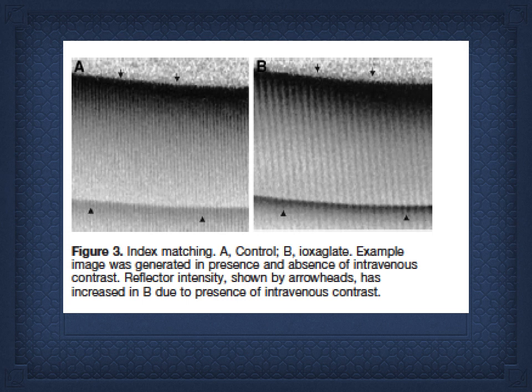In this experiment, we went with things that would not go through the cell membrane to any significant degree. So here we used an X-ray contrast medium. On the left is just an image through blood to the reflector, and you can barely see the reflector. On the right, this material, which we don't have to go into detail on, has a high refractive index. I think it was like 1.7, but it raised the serum refractive index, and we recovered most of the reflection.